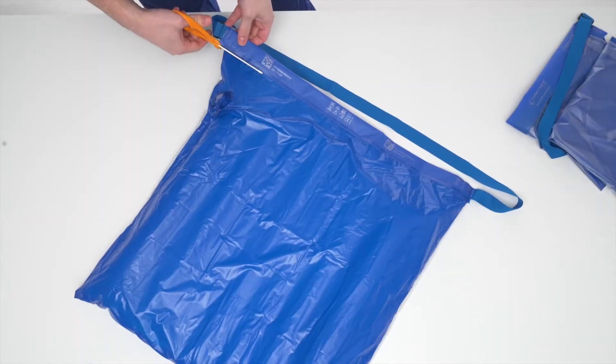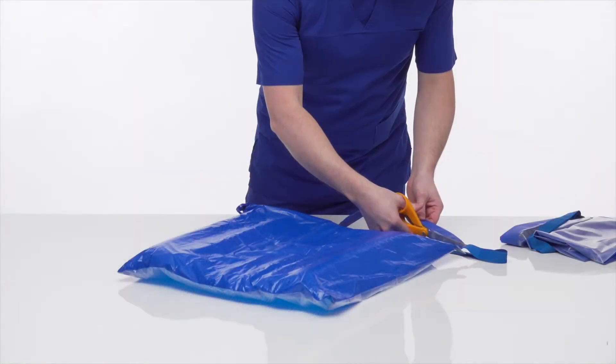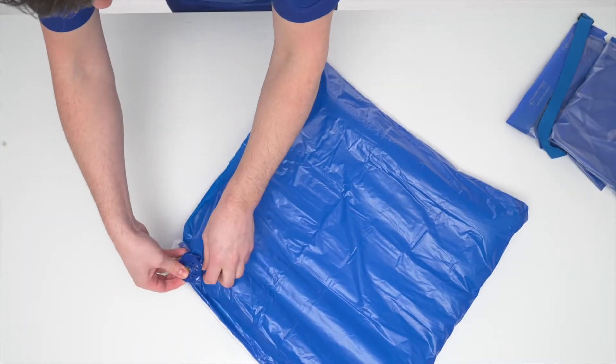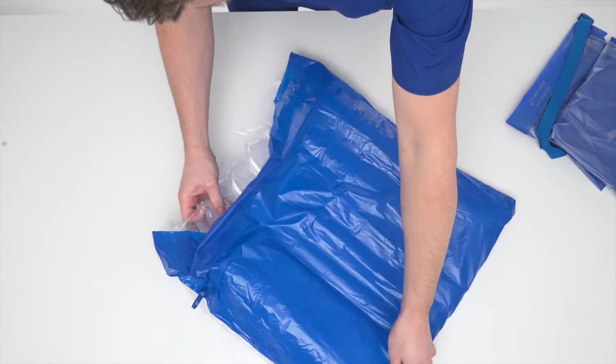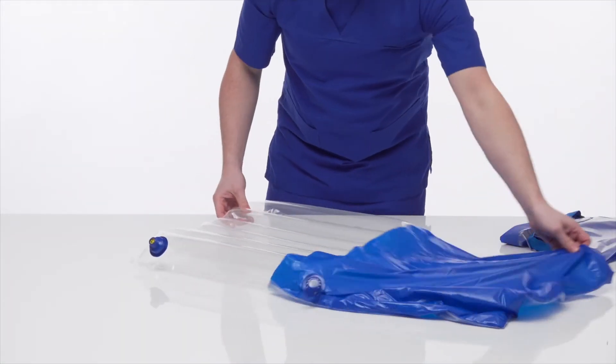Remove the existing outer cover by cutting adjacent to the top blue edging tape using a safety knife or scissors. Lift underneath the blue shroud and push down on the valve to separate it from the outer cover. Remove the inner Repose Cushion from the outer cover.